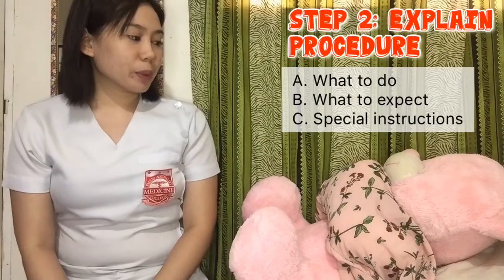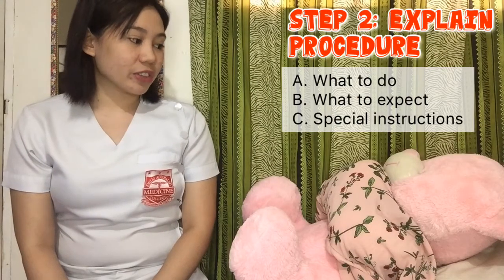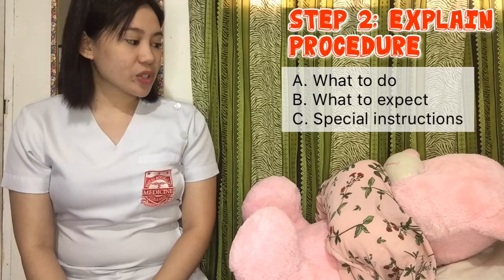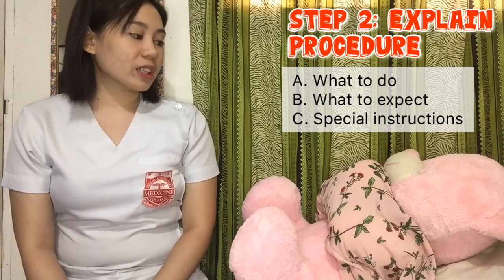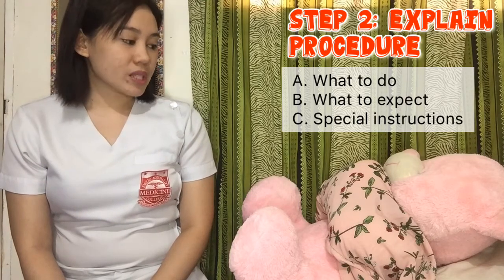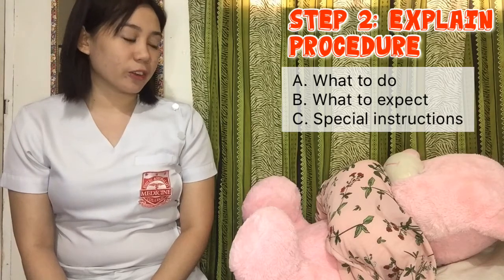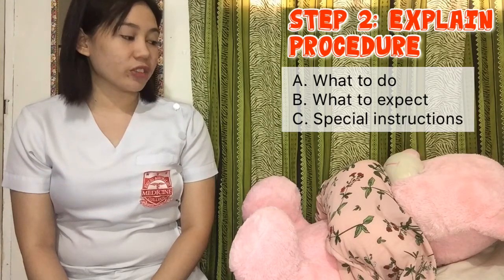Good morning, Ma'am! I'm Dr. Magpantay, your gynecologist for today. I'm going to perform a PAP smear on you to check your cervix. I will insert an instrument we call a vaginal speculum — you will feel it's a bit cold because it's metal. Ma'am, before we start, please empty your bladder so that you won't feel uncomfortable upon insertion of the instrument.